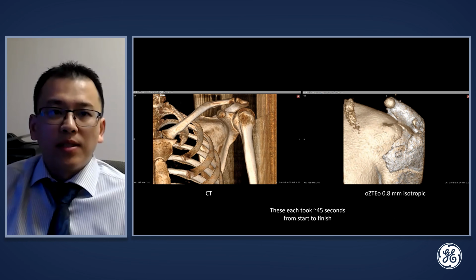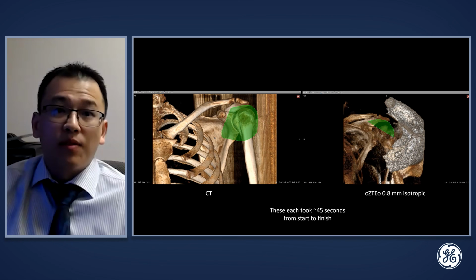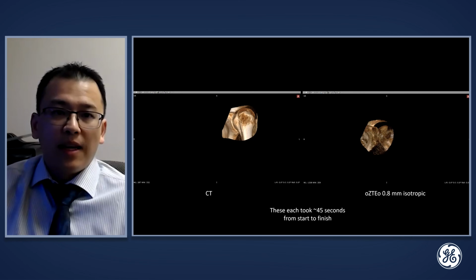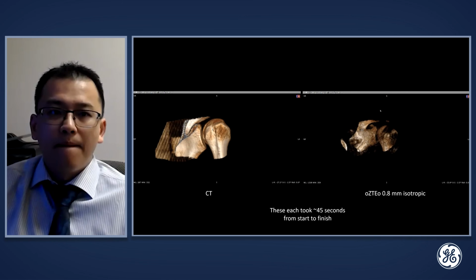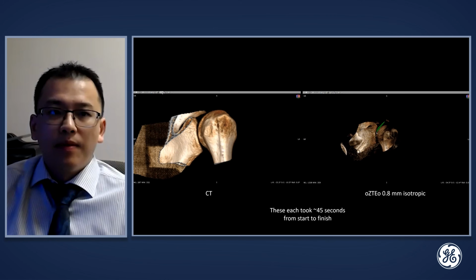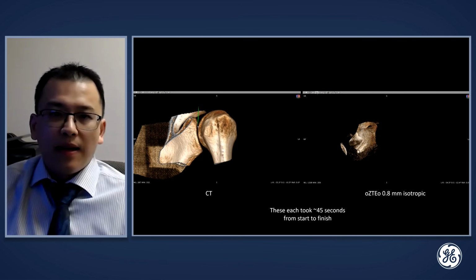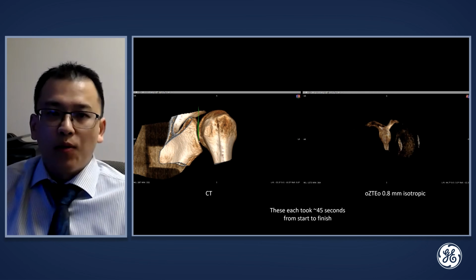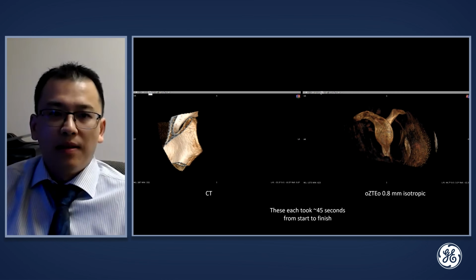For the osteo sequence, windowing and leveling displays the bone. Usually I don't spend too much time cleaning it up at this point, but have it windowed sufficiently to see the glenohumeral joint and to segment it to a smaller volume. From here, I manually remove the humerus, and this leaves an en face glenoid view where we can improve the windowing and leveling to obtain a nice volume rendered image of the glenoid.